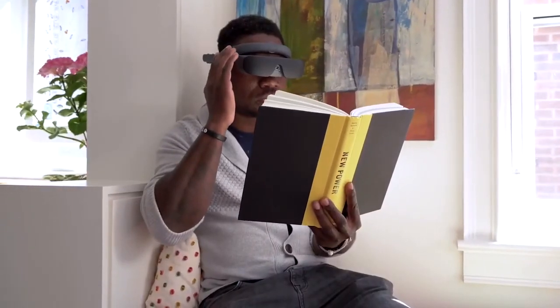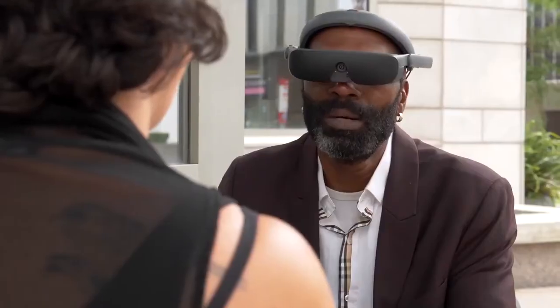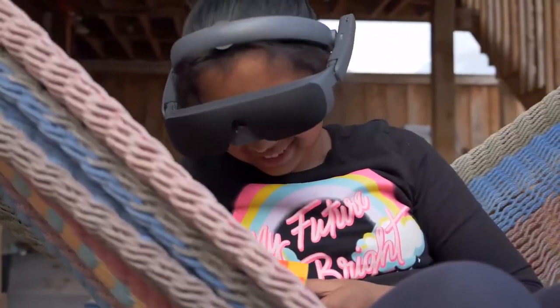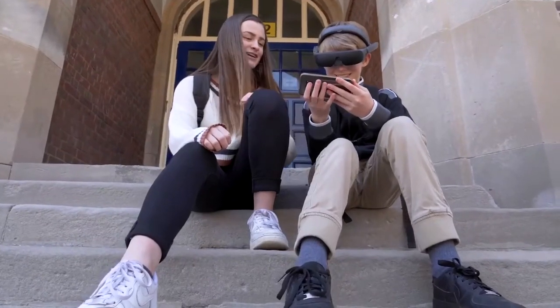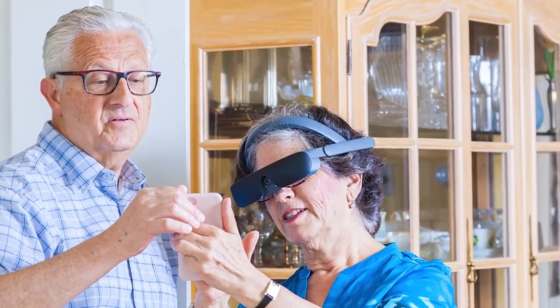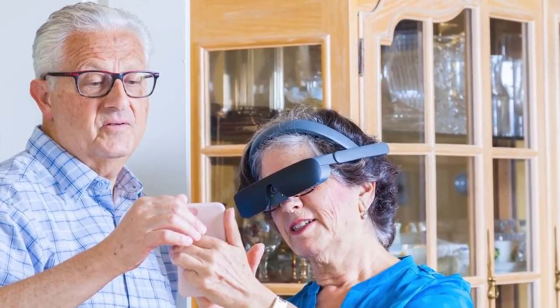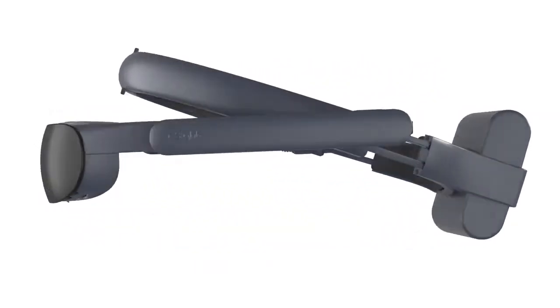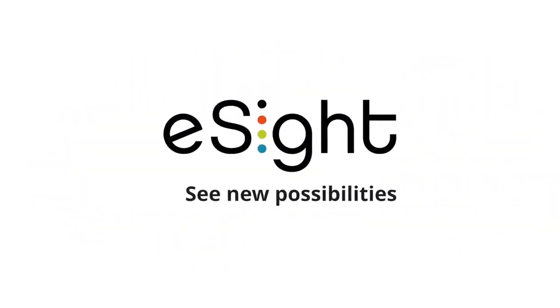Designed for ease of use, eSight 4 provides interactive learning sessions, making it easy for users to learn new features when they are ready. Connected to the internet by Wi-Fi, eSight 4 users receive automatic updates and access to the latest enhancements. Whether you're an individual with partial sight, a distributor of assistive technology, or an eye care specialist — join the community helping thousands of people with low vision and legal blindness see new possibilities.